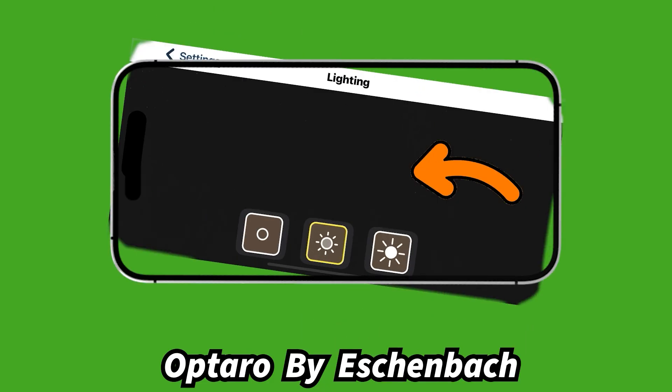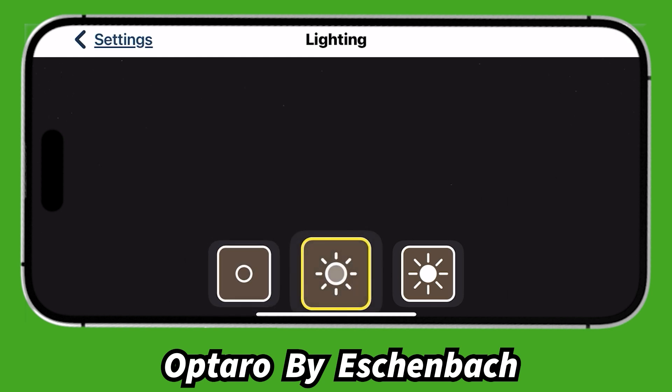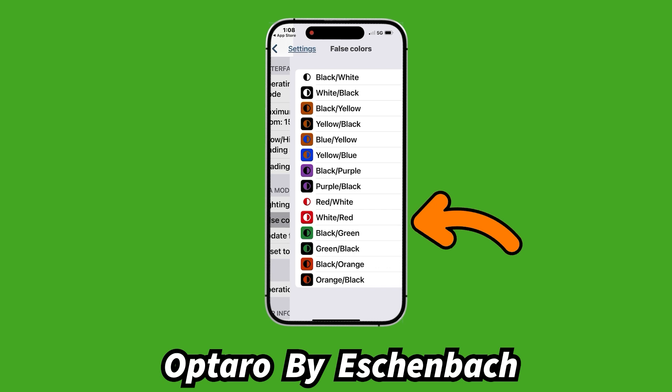There are also lighting options. The device has its own built-in lighting on the back, with three intensity levels: off, medium, and bright. We were on medium — the default — and it worked very well for the magazine. If you're looking at something glossy, medium might be better. The false colors option lets you choose which false colors are available when pressing the color button. There are 14 in total; the defaults are black-on-white and white-on-black.